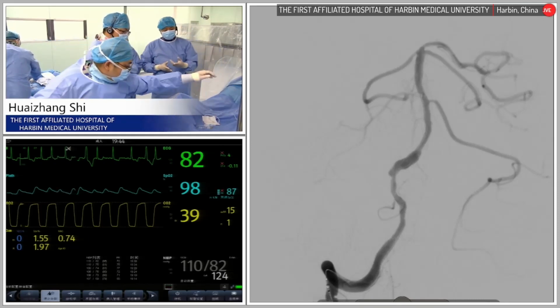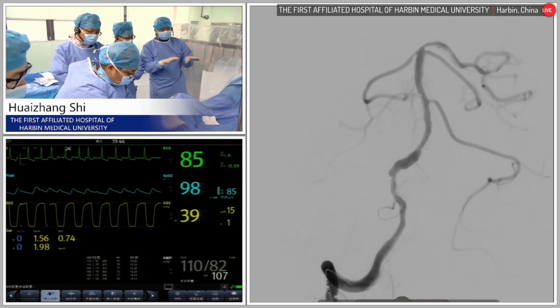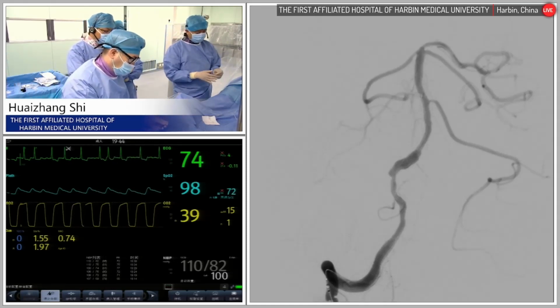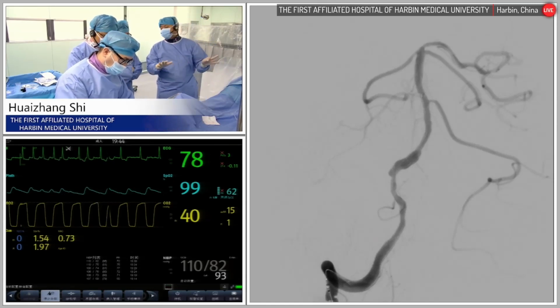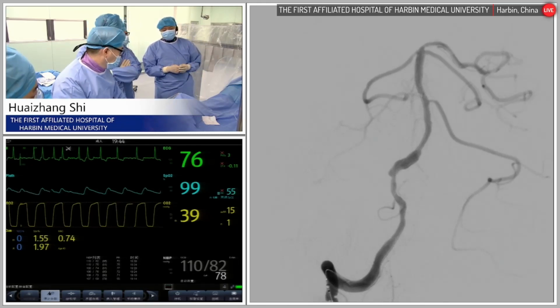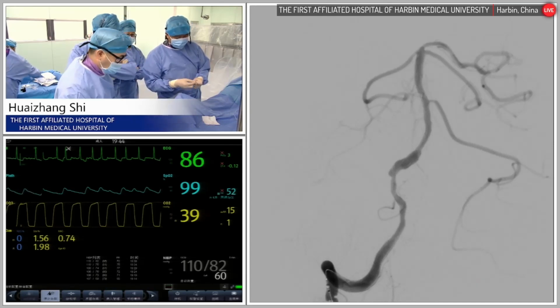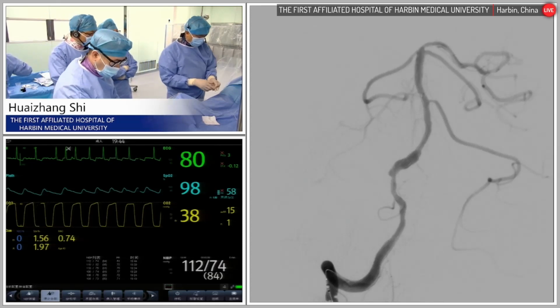For the intracranial lesions, we should maintain all the table clearly, no blood. Yeah, very clean. I like this. It's not like the coronary interventions, where there's a lot of blood on the table. We don't care about that here, because we are very concerned about thrombosis in the cranial vessels.